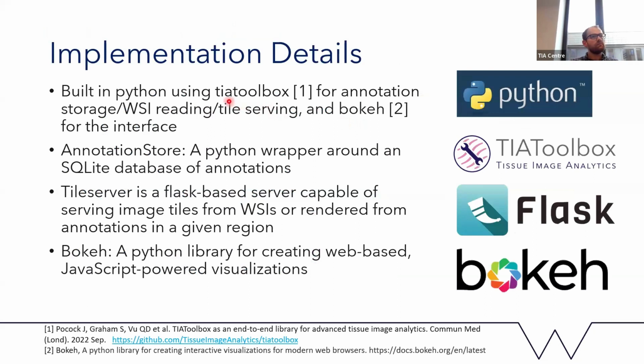So a few implementation details. This is all built in Python, and it uses TIA Toolbox for a lot of its underlying stuff like annotation storage, WSI reading, and tile serving. The interface itself is written in Bokeh, which is basically a Python library for creating web-based visualizations that uses JavaScript behind the scenes, but you actually do the programming in Python. It uses an annotation store to manage the annotations if you're overlaying annotations. And the tile server is a Flask-based server that's capable of serving tiles from WSIs or rendering from annotations, depending on what you're doing.